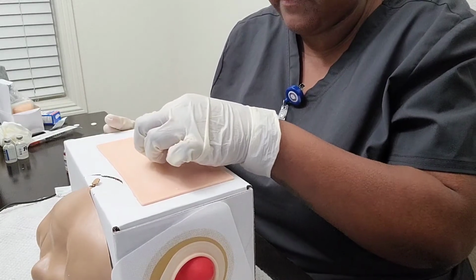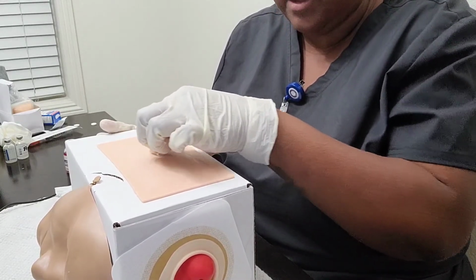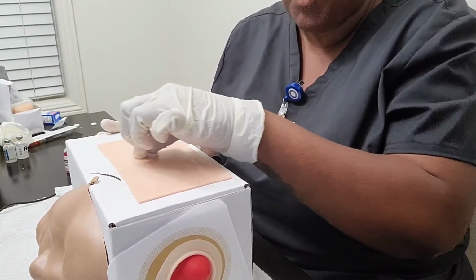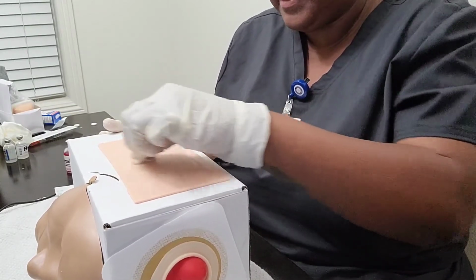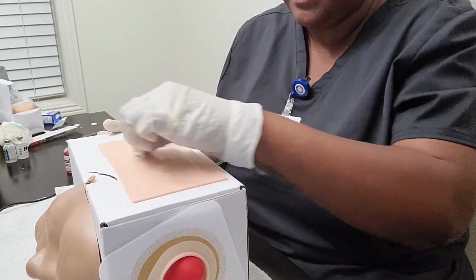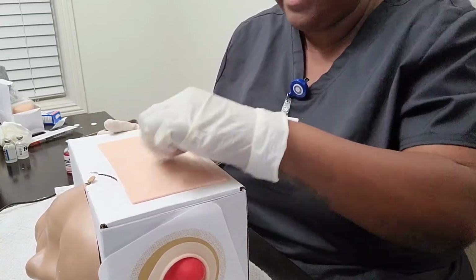So I'm going to first start, and then I'm going to go larger, wider, outwards in a circular motion for about 5 centimeters or 2 inches of the area.